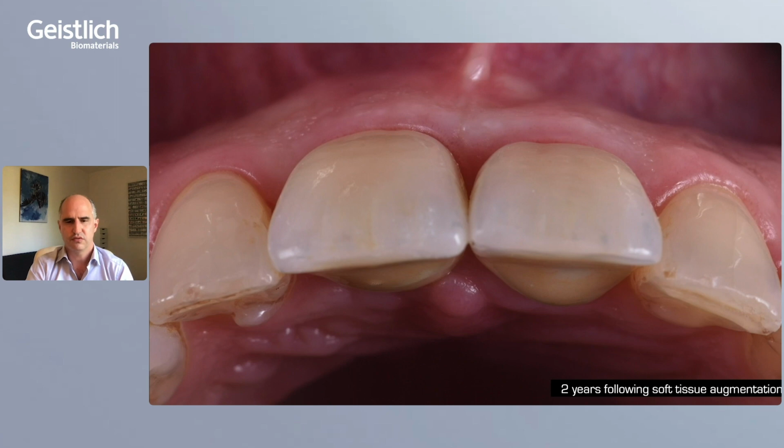And just to document the long-term stability of these materials, you see also this seems to be good. It's 2 years following soft tissue augmentation with Fibro-Gide. You see there's literally no change. There's no shrinkage over time in this case.